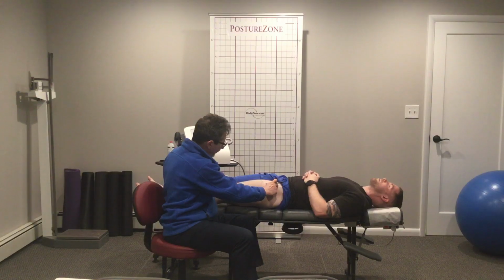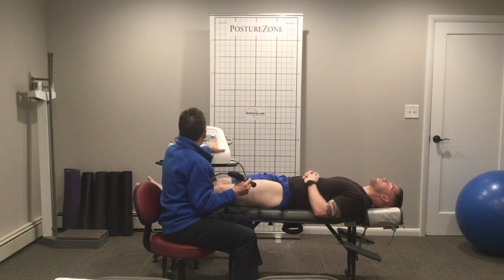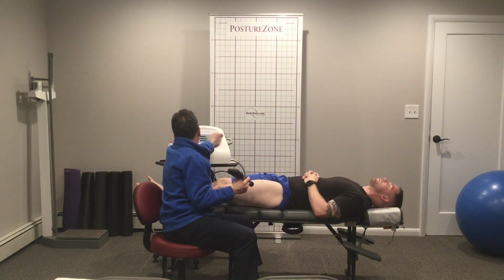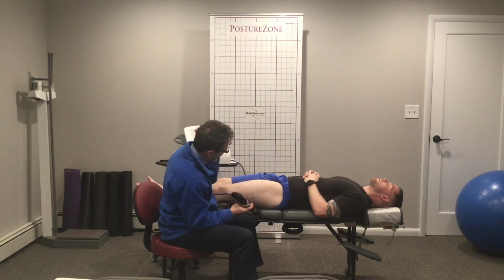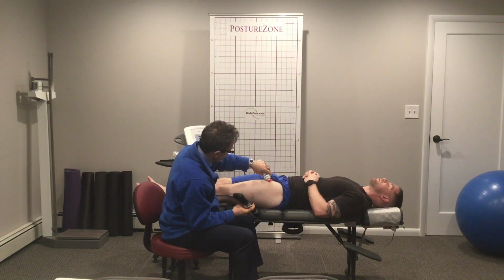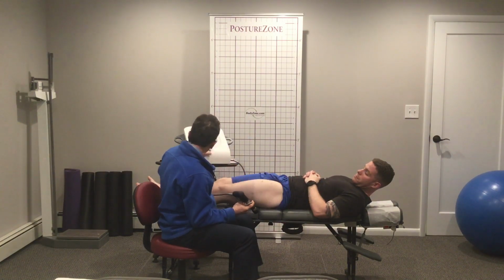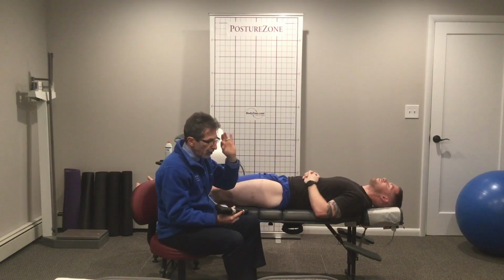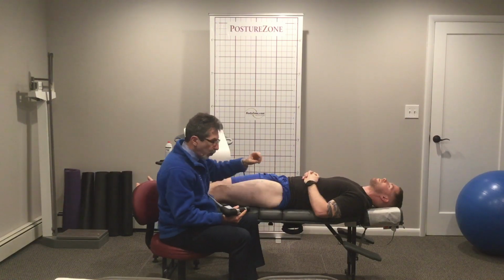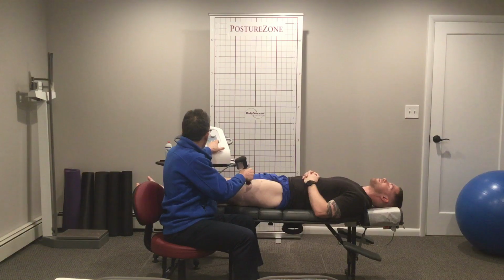We're going to want to go above and below it at a relatively high frequency and low bars. It's a thick muscle, so I would do like 1.3 bar, and I'd probably do it about 18 hertz. Why? Because I want to get a little bit of that wave. Remember, radial pulse wave is like dropping pebbles in a pond, all right? You don't always have to hit the bullseye. That wave over here, when it crashes in on the shore, could be all you really need.